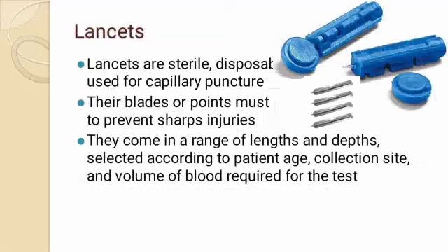Lancets are sterilized disposable devices used for capillary puncture. They come in a range of lengths and depths. Select according to patient age, collection site, and volume of blood required for the test. Their blades and points must be retracted or shielded to prevent sharp injuries.